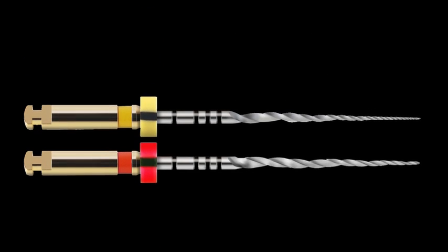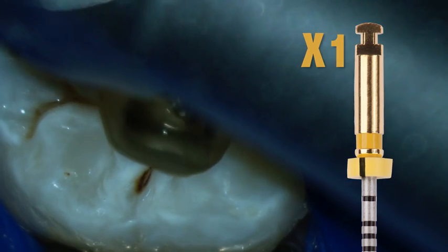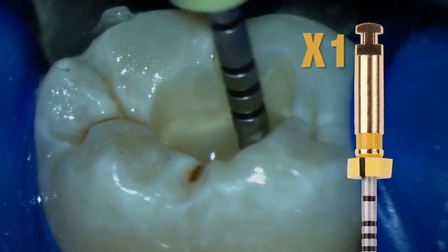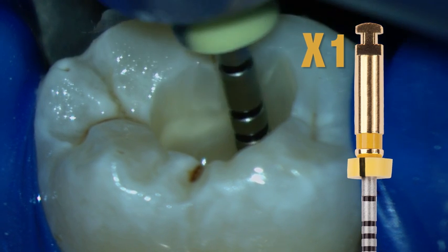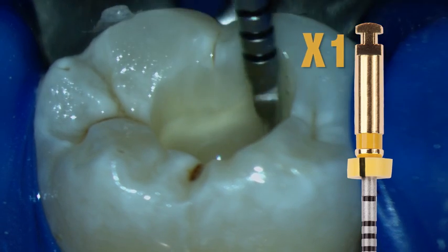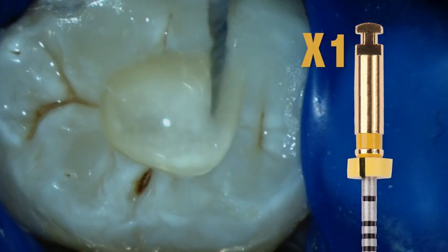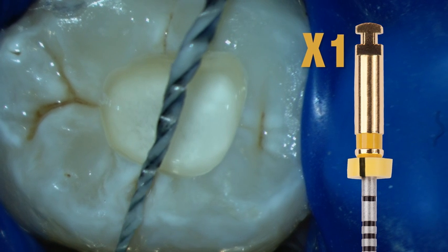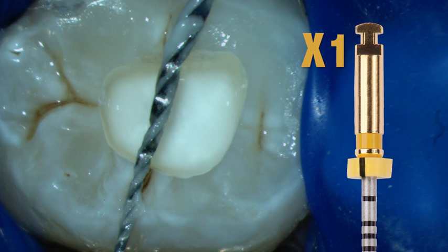The first instrument in the sequence is always the X1. The instrument is used in essentially a push-pull fashion over a short amplitude of 1 to 2 millimeters. It should be noted that the use of ProTaper Next does not require brushing, but we show some here because I know a lot of you find this useful in removing restrictive dentin in the coronal 1/3 of the preparation. As can be seen, significant amounts of dentinal debris are generated and carried coronally with these instruments.